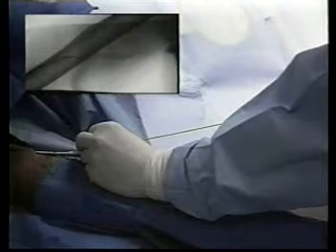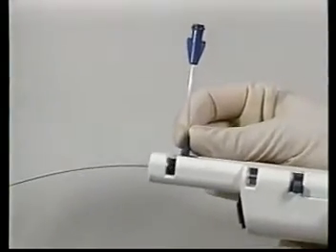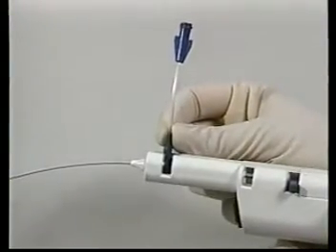When the basket reaches the tip of the access sheath, turn off the rotator. Place the device into the compressed position. Advance the tip to the venous anastomosis in preparation for repeating the procedure.